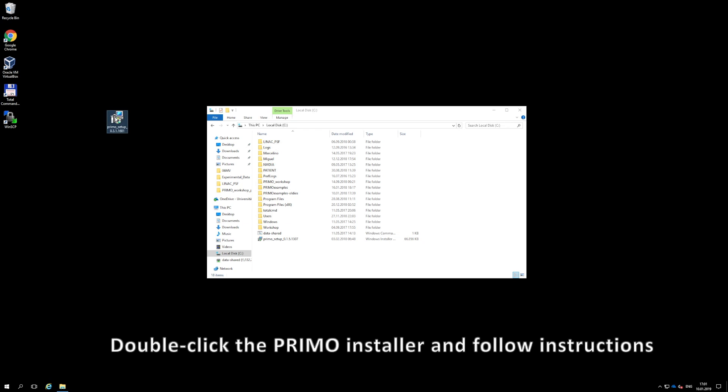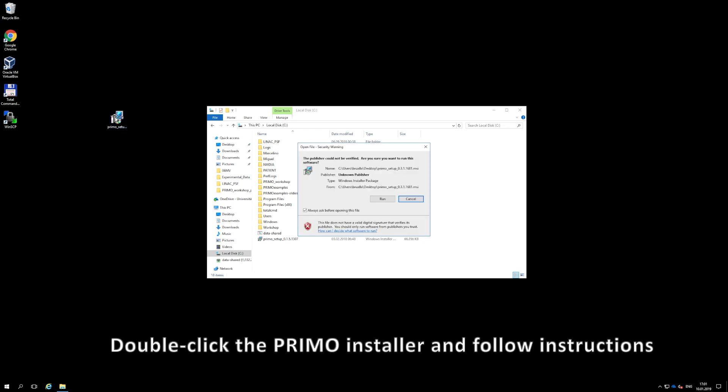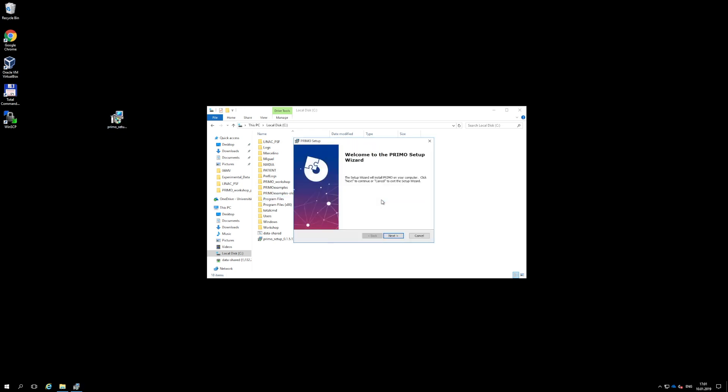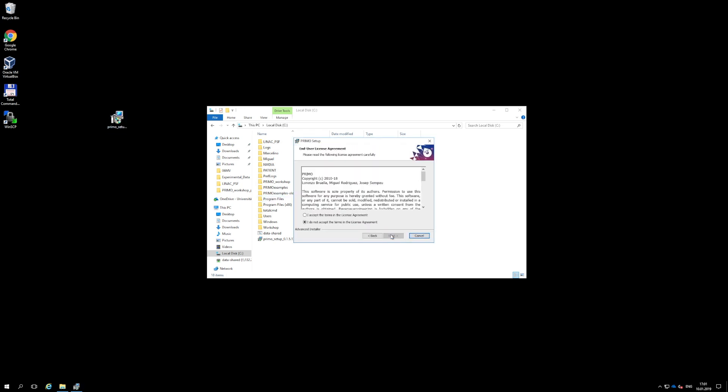Once any previous version has been removed, double-click the installer file that you have just downloaded and follow the procedure indicated by the installer.